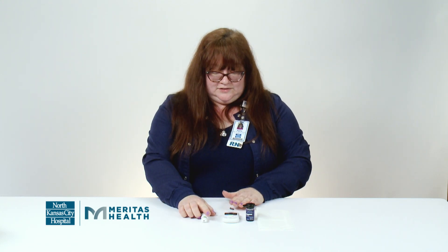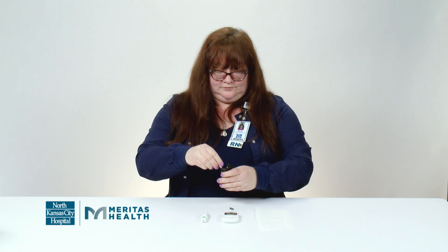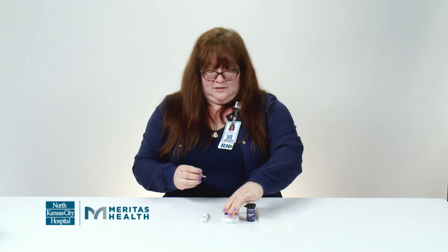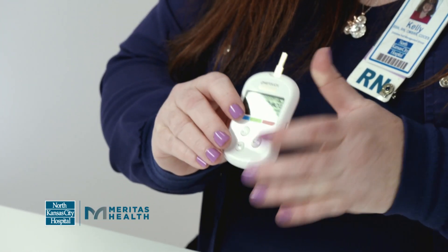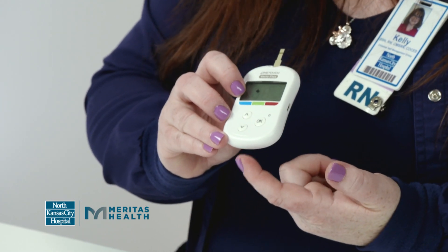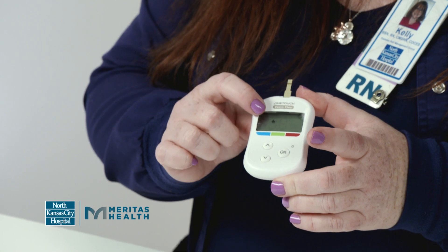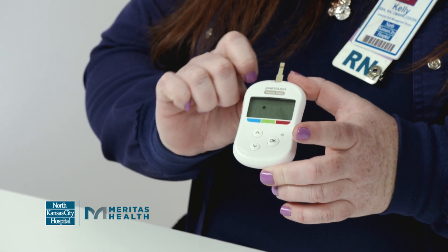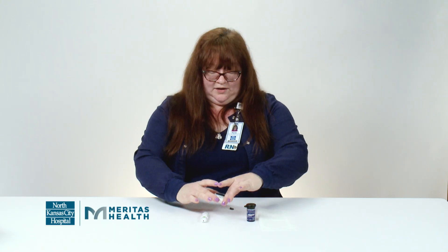Now that we have that loaded, we want to get our test strip out. I'm going to put the test strip into your meter. On this meter, it goes into the top of the device. On some other meters, you can load it to the bottom. You want to make sure that you see the blood icon come up on the screen — that means it's ready for you to poke your finger.